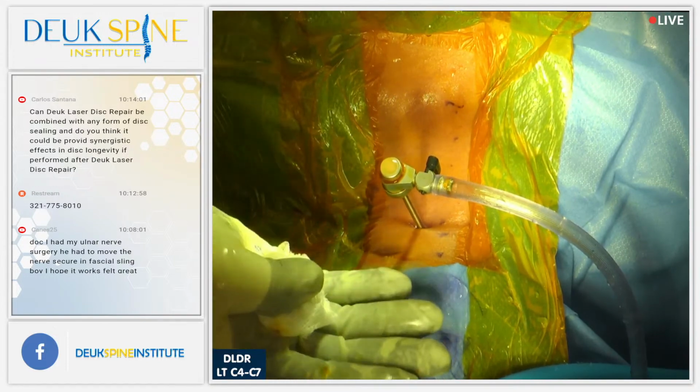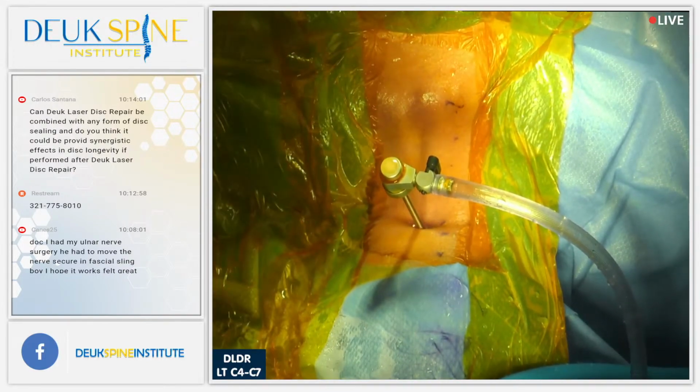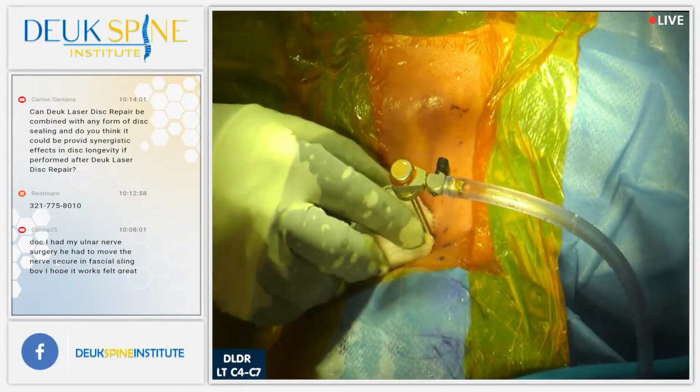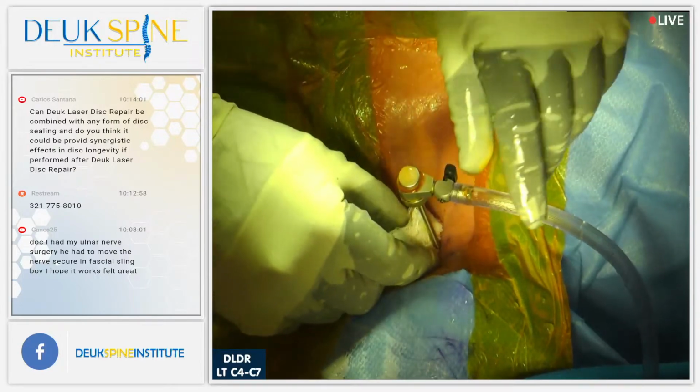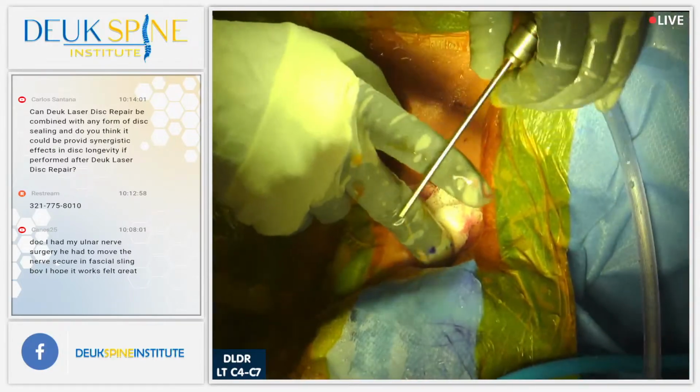So this is her face looking up at you, her chest here, her neck here. We did 1 4-millimeter incision, and I fixed 3 herniated discs, degenerated discs with that 1 incision. Okay? I'm going to take this tube out, and just take a look at this tube.